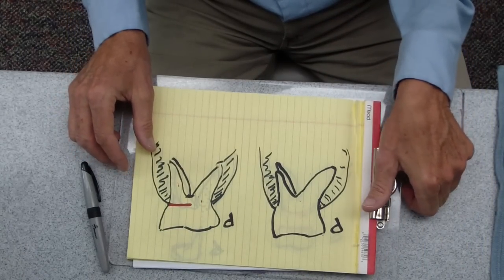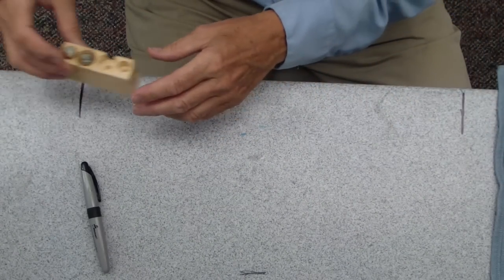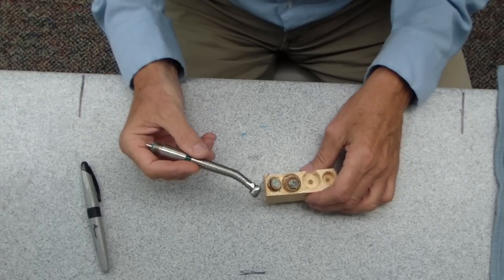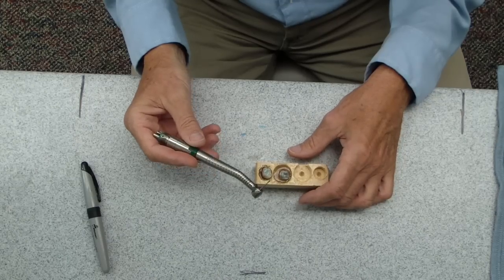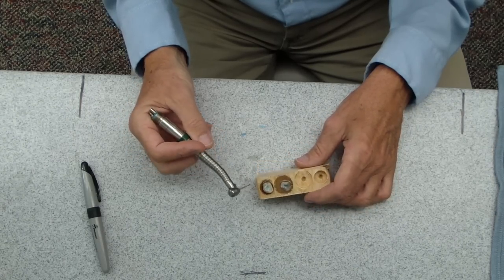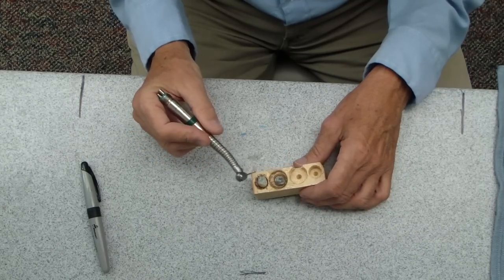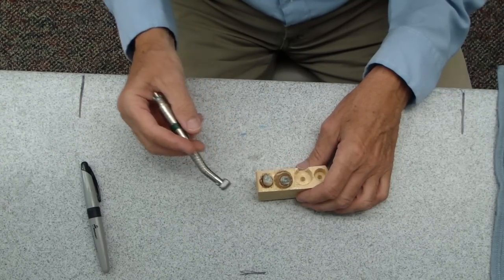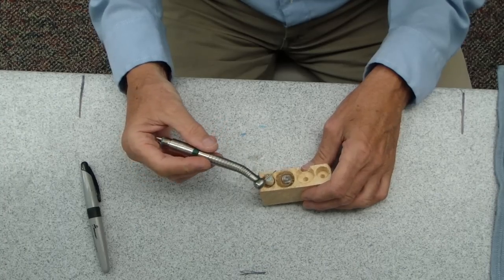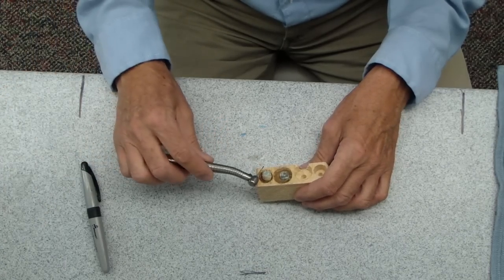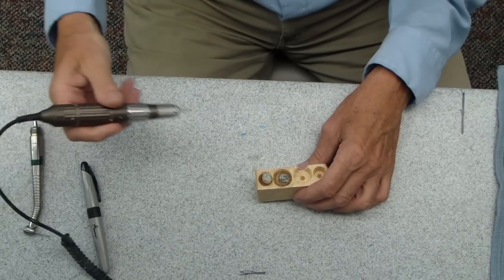We'll try to demonstrate that here with our extracted teeth models. I like to use your standard handpiece that you use, contra-angle handpiece. It's kind of hard to get the surgical handpiece back in there, and general dentists are more adept with this, so it's an excellent handpiece. For this demonstration purposes here in the lab, we're going to use a straight handpiece, but I would use a contra-angle standard high-speed handpiece. Don't have to worry too much about air embolism here because we're not laying any flaps in there, but you can use an impact air if you want to if you're concerned about air embolism.